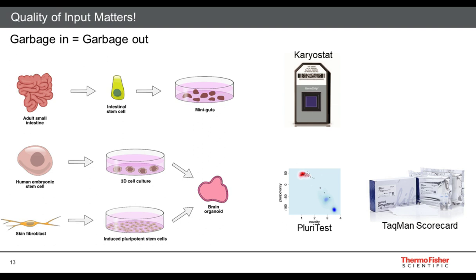that these models remain fairly stable and don't start accumulating abnormalities at rates that are more common than they are in other 2D cell culture systems. And of course, doing regular mycoplasma testing is a standard in cell culture, but also important to remember to do.